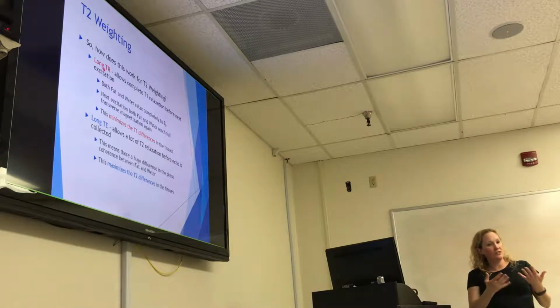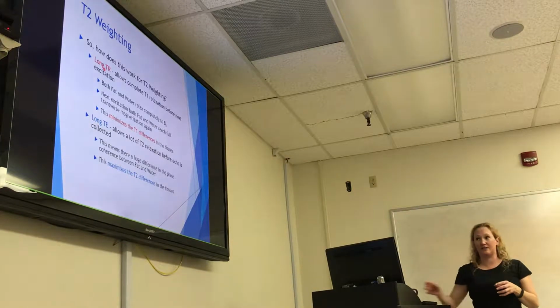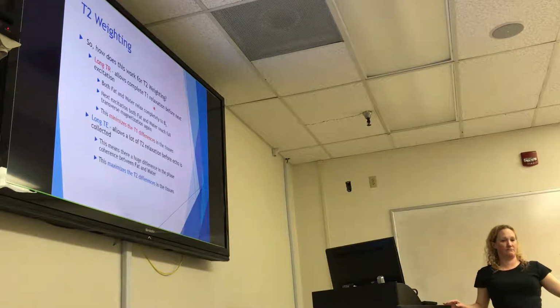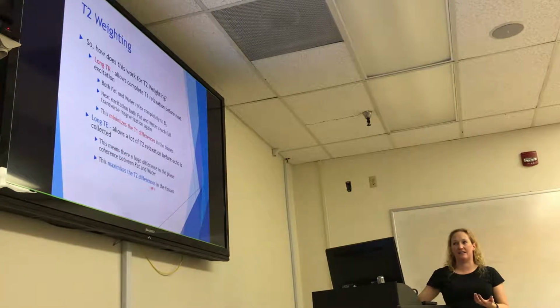And our water is still going to be pretty well in phase, which means more signal. All right, so we're going to minimize these T1 differences by waiting a really long time before we come back to slice 1. But we're also going to wait a long enough time that there are these T2 differences between our tissues. We're maximizing our T2, we're minimizing our T1.